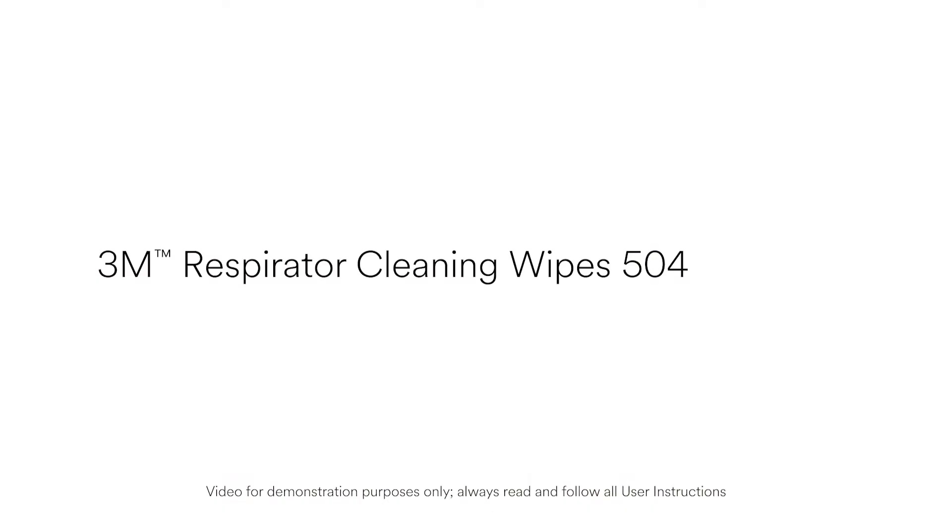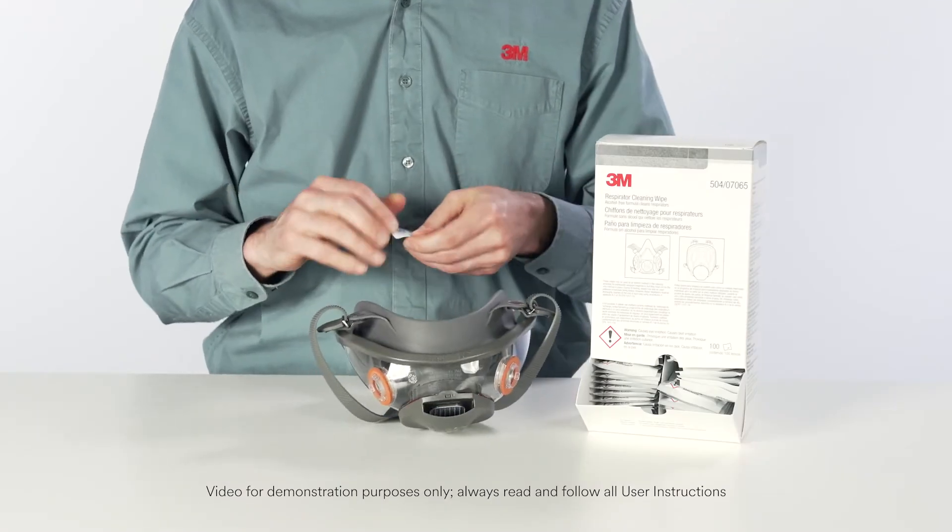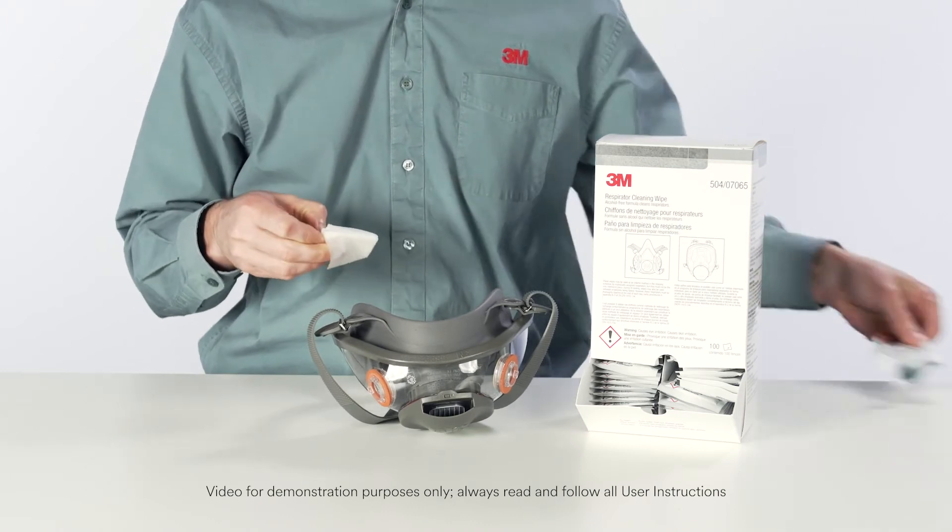3M respirator cleaning wipes 504 may be used as an interim method in the cleaning schedule for individually assigned respirators, but they must not be the only cleaning method in place.